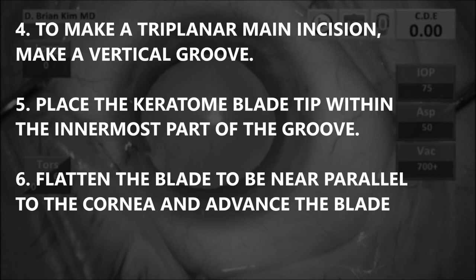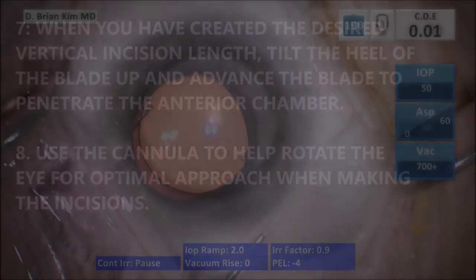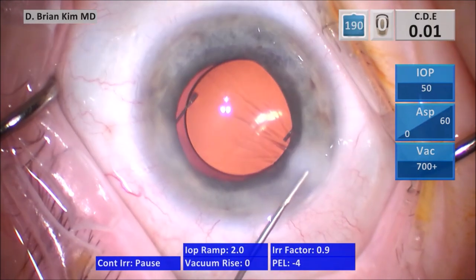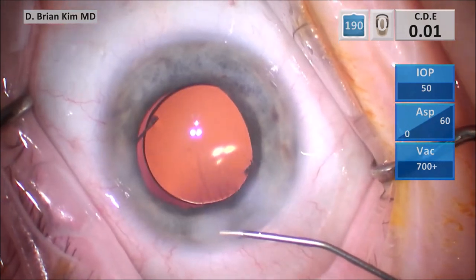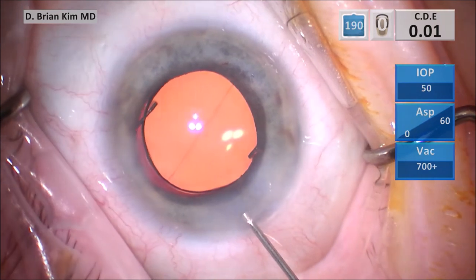Number four — to make a triplanar main incision, place the keratome blade tip within the innermost part of the groove. Flatten the blade out to be near parallel to the cornea and advance the blade. When you've created the desired vertical incision length, tilt the heel of the blade up and advance the blade to penetrate the anterior chamber. Number eight: use a cannula to help rotate the eye for optimal approach when making these incisions. I prefer hydrating the sides first, then trying to catch an area of stromal hydration and start hydrating the roof, sweeping side to side.